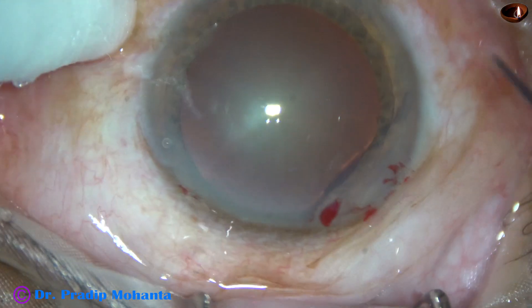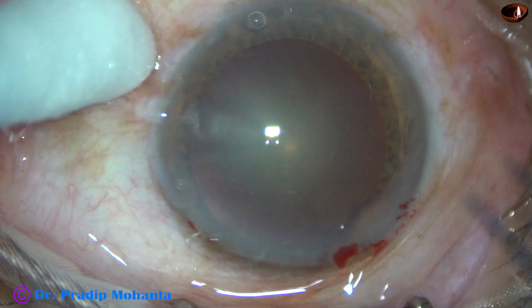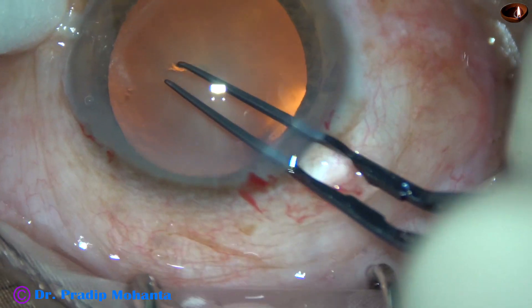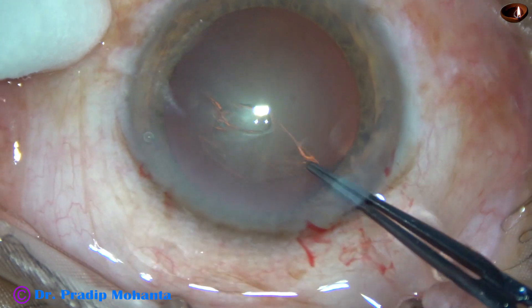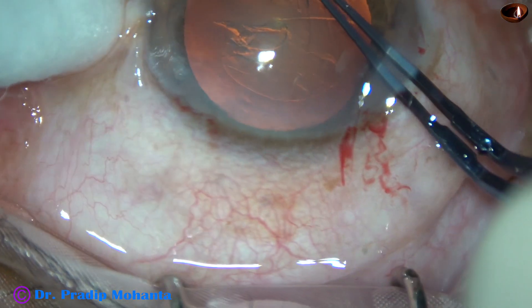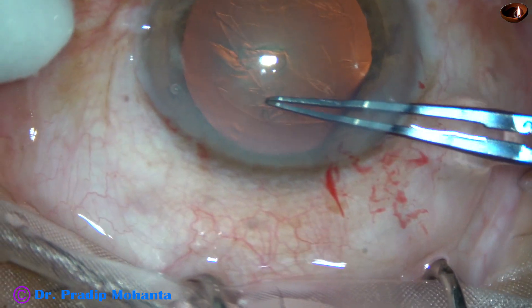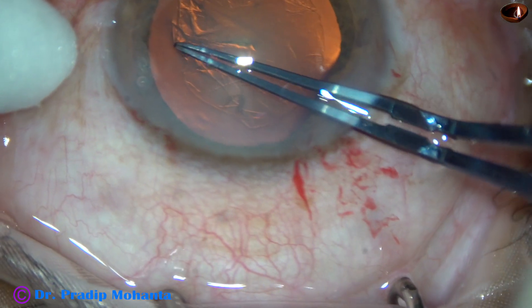And now capsulorhexis is being done with the help of the phaco forceps. The capsular tag is raised. This capsular tag is guided anticlockwise all around to get an adequate size rhexis of about 5.5 mm.